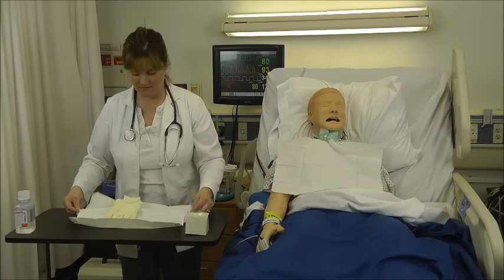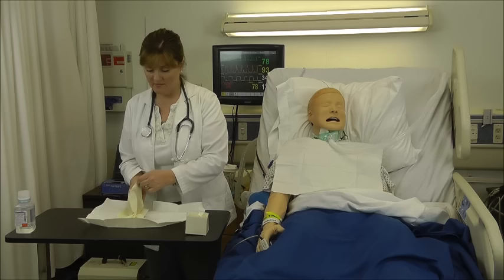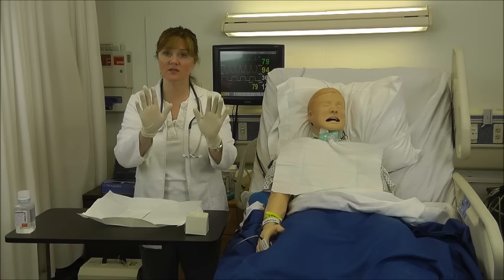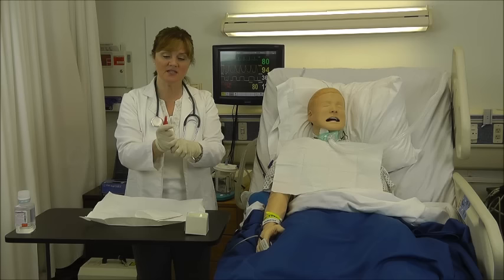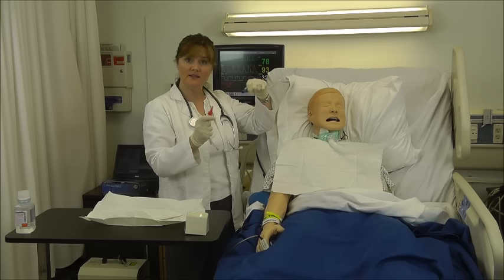Now I'll put on my sterile gloves, touching just the inside of the glove that will be against my wrist. I'll hold the package and put all four fingers in the cuff of the second glove, keeping my thumb away so I don't contaminate either of my hands. I'll remove the suction catheter. I want to keep the catheter itself sterile, so I'll keep that tucked in my hand with just the connector sticking out. Now my left hand is no longer sterile, it's just clean because I'm holding something that's not sterile. I'll connect these two.